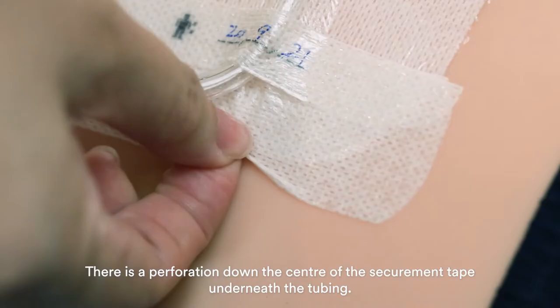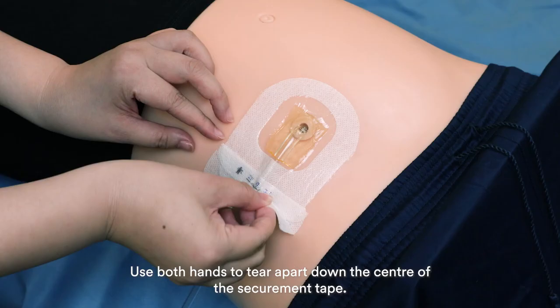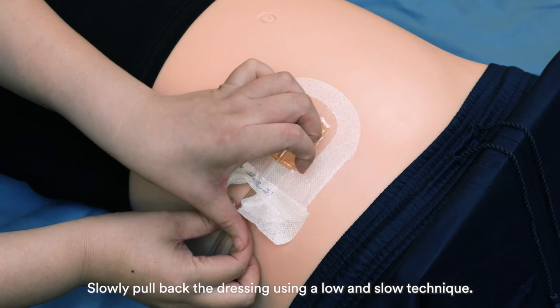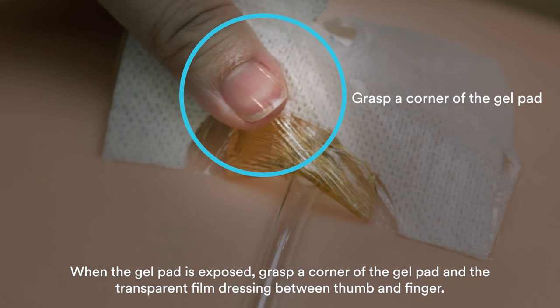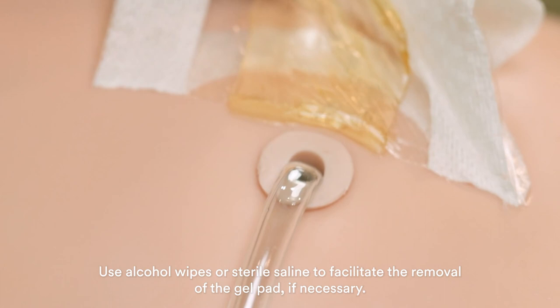To remove the old dressing, there is a perforation down the center of the securement tape underneath the tubing. Use both hands to tear apart down the center of the securement tape. Hold and support the tubing and slowly remove the notch end of the dressing from the skin. Slowly pull back the dressing using a low and slow technique. Avoid skin trauma by peeling the dressing back rather than pulling it up from the skin. When the gel pad is exposed, grasp a corner of the gel pad and the transparent film dressing between thumb and finger. Continue to remove the dressing low and slow while supporting the skin until the dressing is completely removed, then discard. Use alcohol wipes or saline to facilitate the removal of the gel pad if necessary.